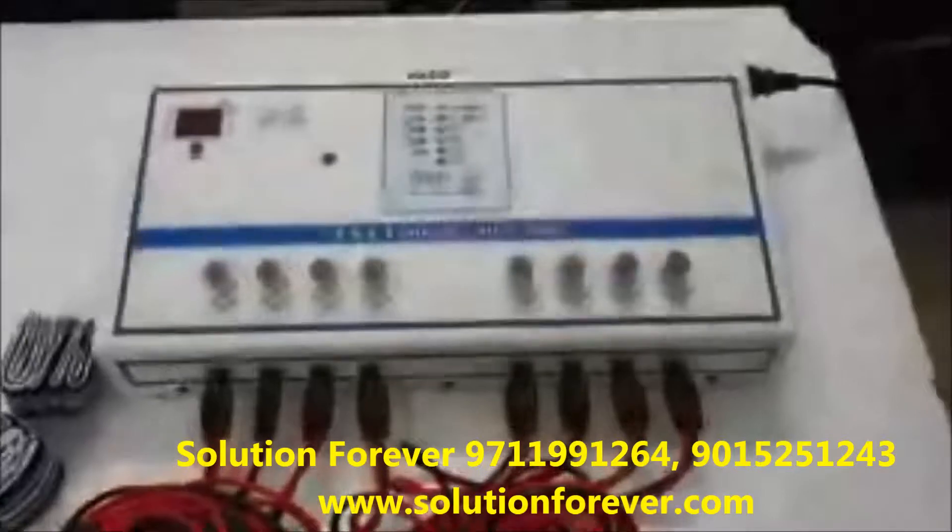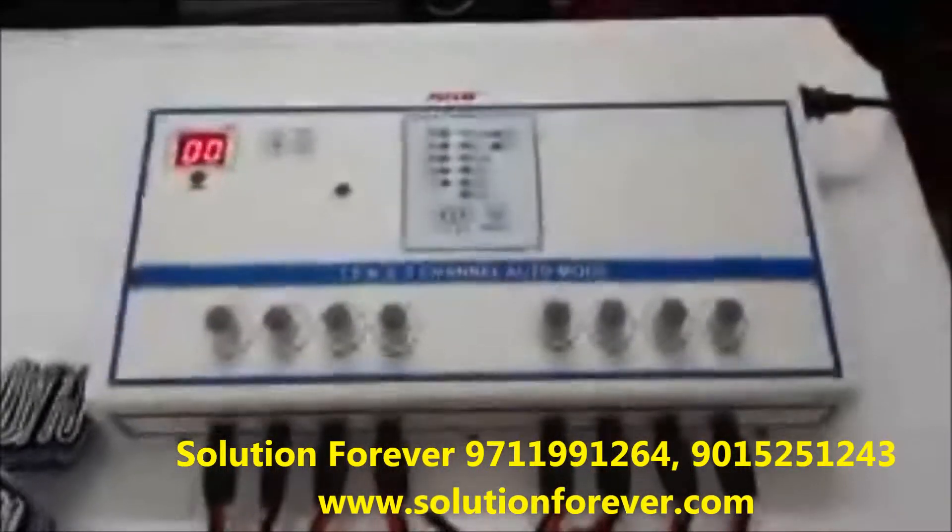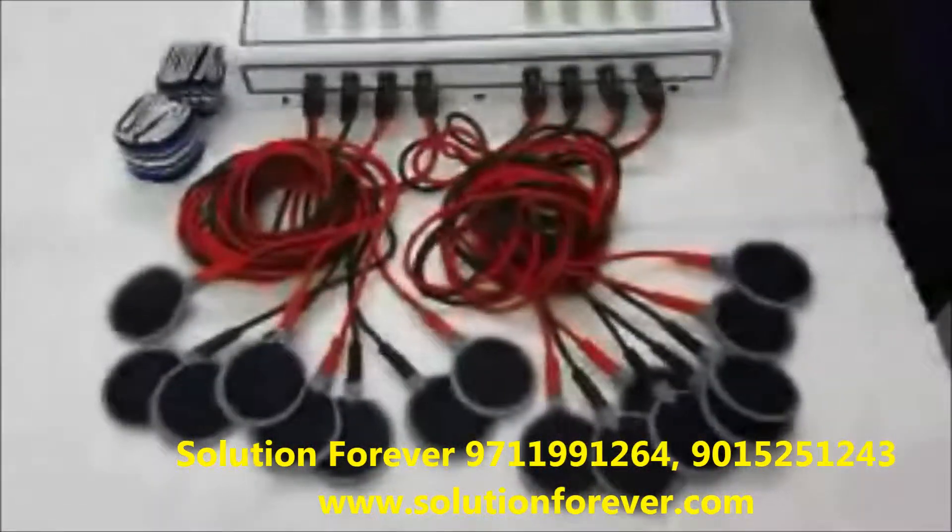Now we will show you the demo of Echo 10's 8 channel auto mode. Switch on the machine, attach wiring pads, and set the timer as per your need.